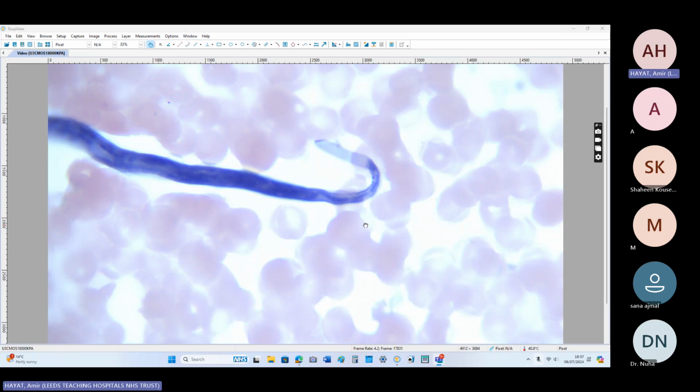So they will ask, report the blood film. So what would you say? How to formulate a report for the exam? Depending upon the morphology of RBCs, there could be anemia or it could be unremarkable. TLC usually would be eosinophilia. So start with the eosinophilia.